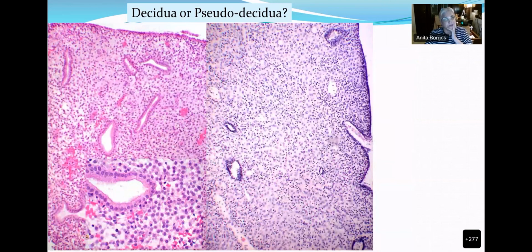Now what is this? Anybody? Aishwarya, I've got two pictures over here. So now tell me, what would you say about this endometrium? The one on the left shows decidualization. Okay, what do you mean by decidualization? This change in the cellular characters with increased cytoplasm, which initially starts around the arterioles and then subepithelial cells.